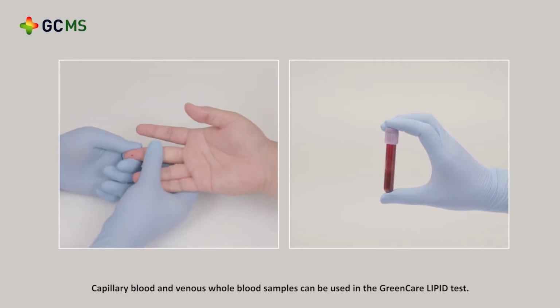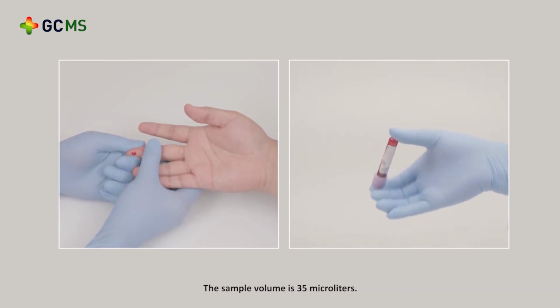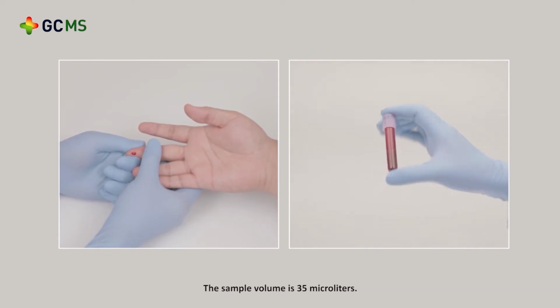Capillary blood and venous whole blood samples can be used in the GreenCare Lipid test. The sample volume is 35 microliters.